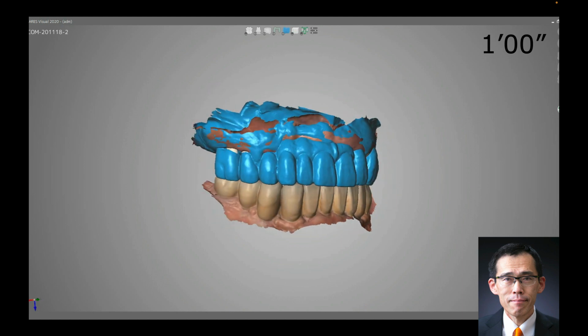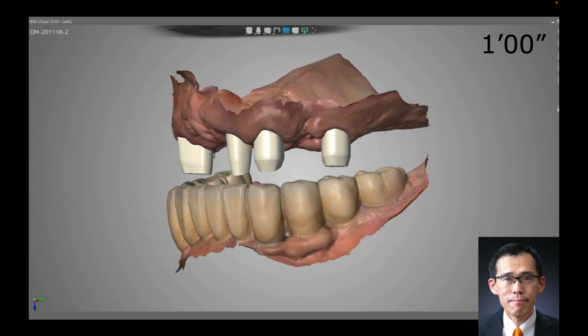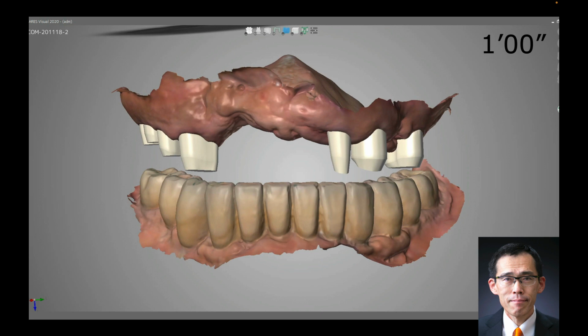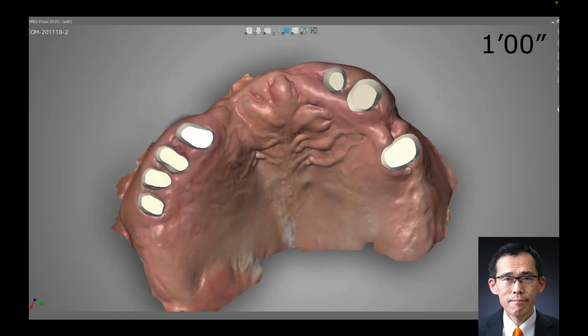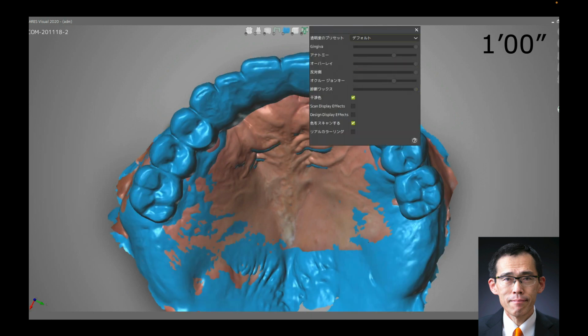This is the CAD design of the zirconia and PEEK bridge. This software is Straumann's CARES Visual. You can see the video of fabricating the inner zirconia crown and outer PEEK bridge.